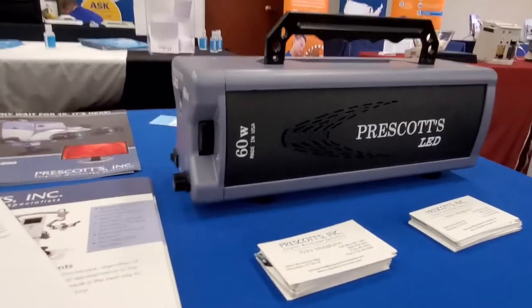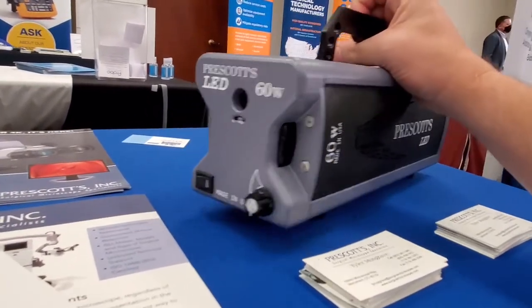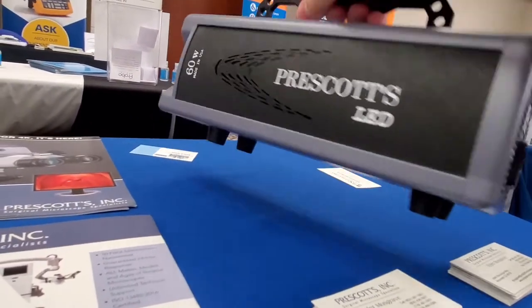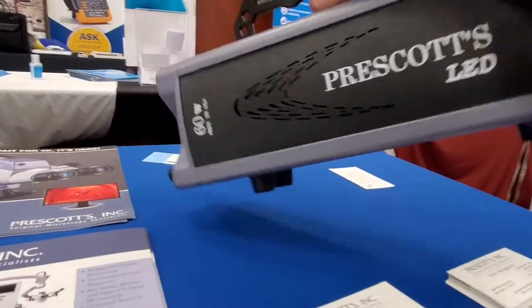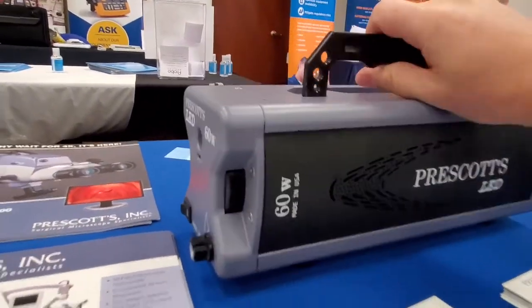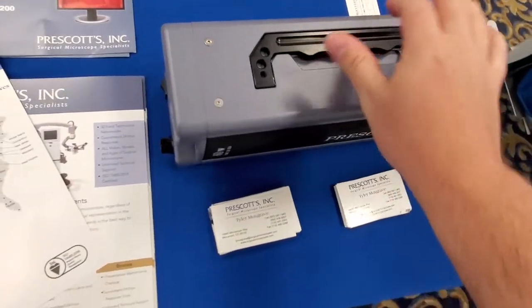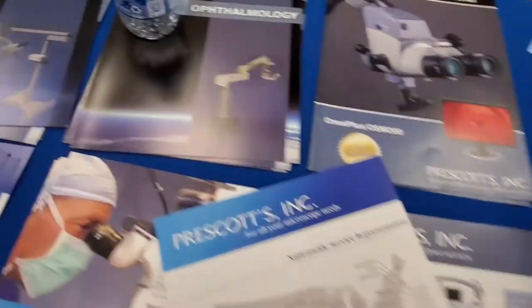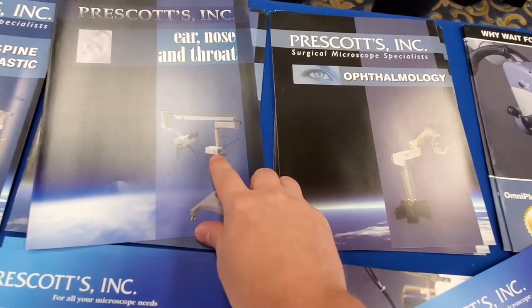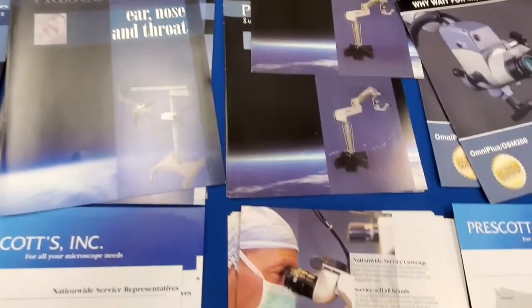Look at this. This is Prescott's 60-watt LED light source, and this thing is all metal. I would say it's probably five, six pounds, something like that. So it's not that light, but it's very well made. What this is designed to do is retrofit existing microscope systems to an LED light source.